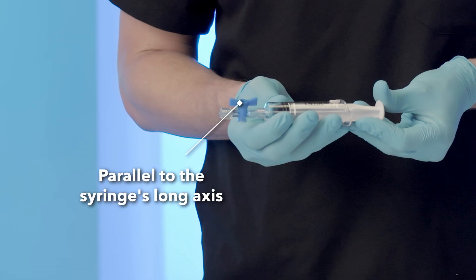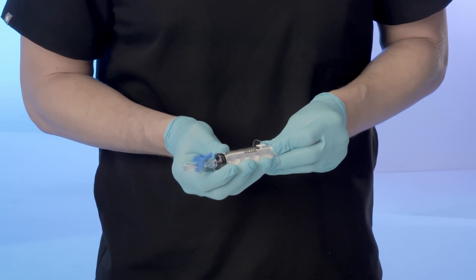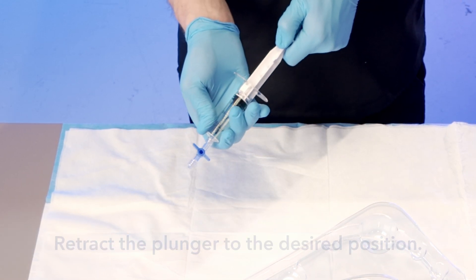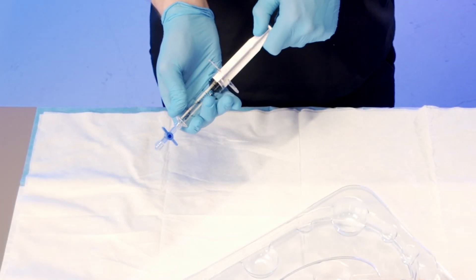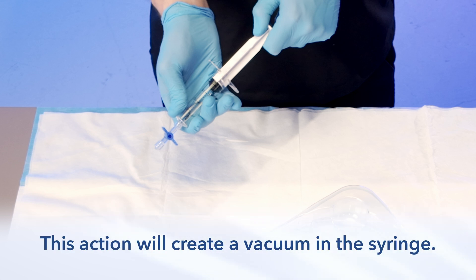Setup Process: Examine the syringe and stopcock. Open the stopcock by turning the lever arm until it is parallel to the syringe's long axis. Fully advance the plunger and rotate it counterclockwise until it stops. Turn the stopcock 90 degrees to the closed position. Retract the plunger to the desired position — 5, 10, 15, or 20 milliliters. Lock the plunger in place by rotating it clockwise to lock the fins behind the syringe stop pin.